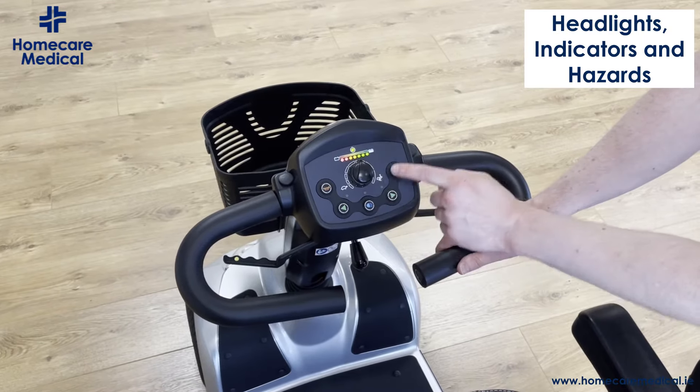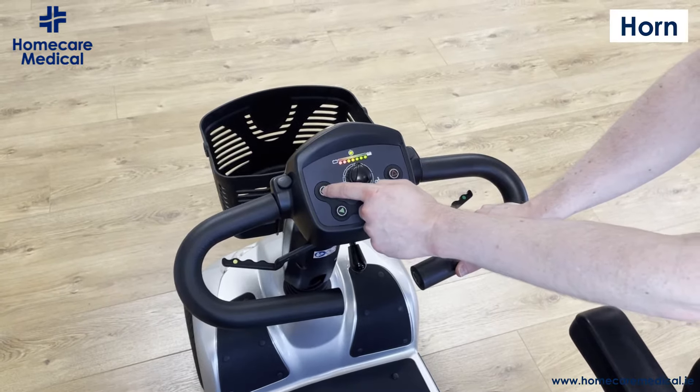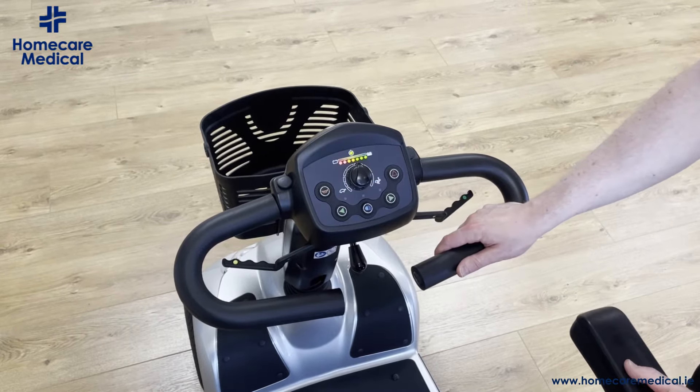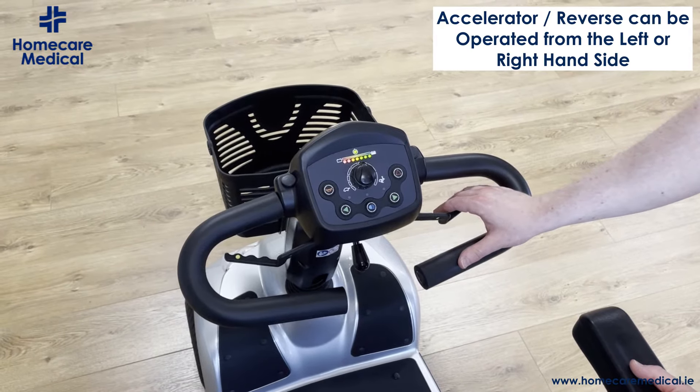You have a lighting system operated by this button here, indicators for both right and left, hazard lights here on the top right, and this button here will operate the horn.